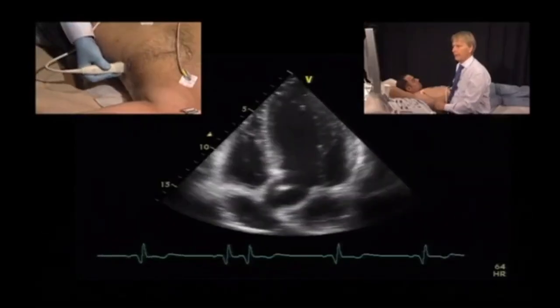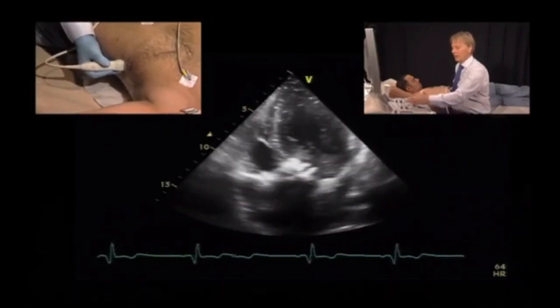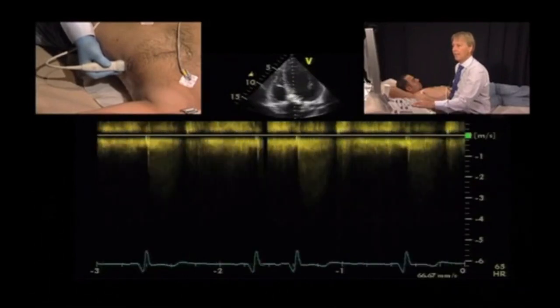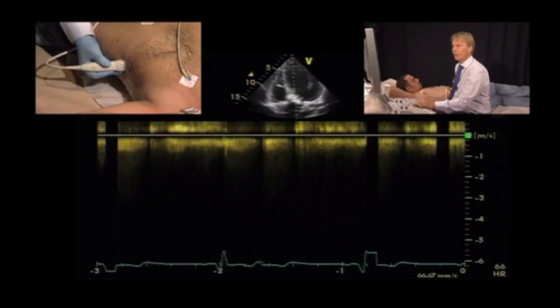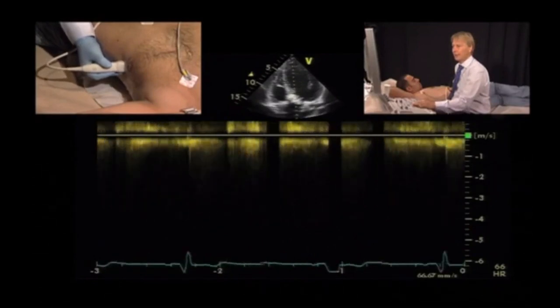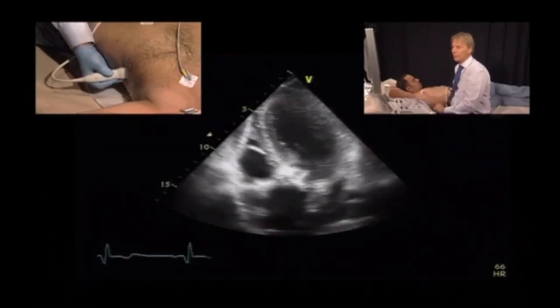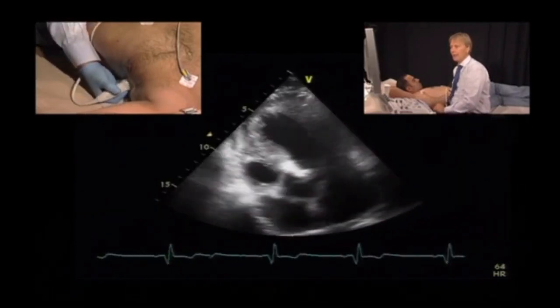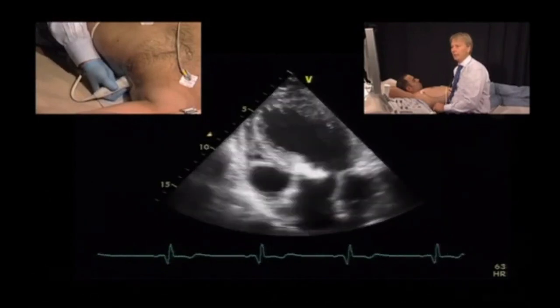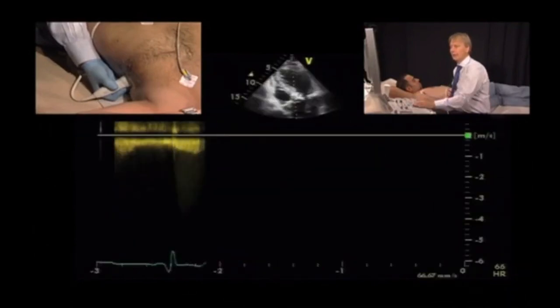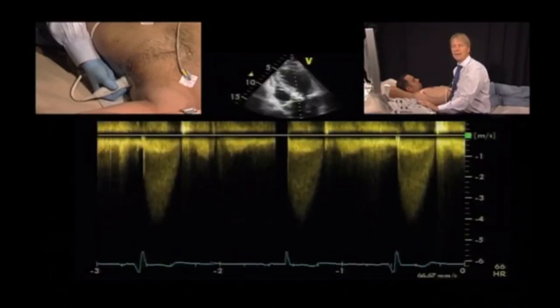To quantify aortic stenosis with CW Doppler, start from the apical approach and try to get an apical five-chamber view, placing the continuous wave Doppler cursor right inside the valve. It's very important to put the focus point exactly where the valve is. If the spectrum is not very good, you can optimize the signal by moving your transducer further lateral to achieve a better angle parallel to the ultrasound beam, which will usually give you much higher gradients and a much better spectrum.